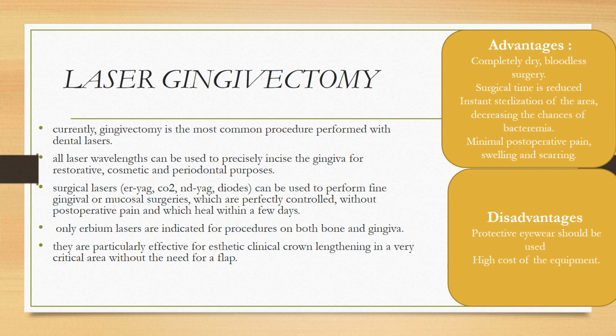These can all be used to perform gingival or mucosal surgeries that are perfectly controlled, without postoperative pain, and which heal within a few days. Only erbium lasers are indicated for procedures on bone and gingiva. They are particularly effective for aesthetic crown lengthening in a very critical area without the need of a flap. So that is the laser gingivectomy.